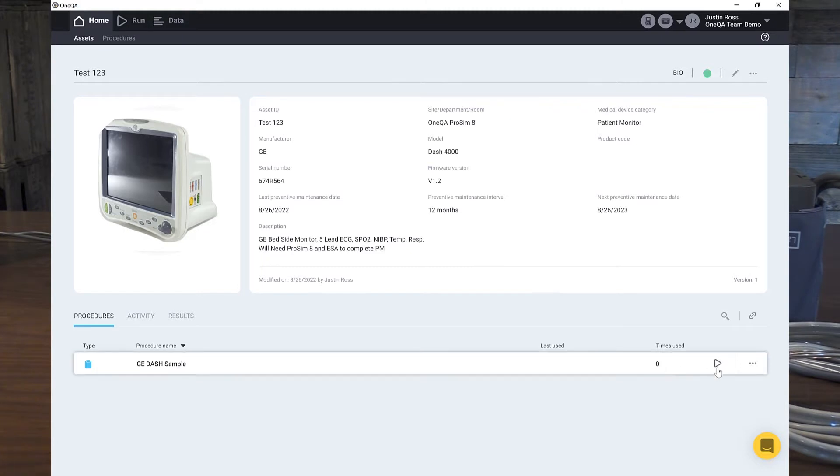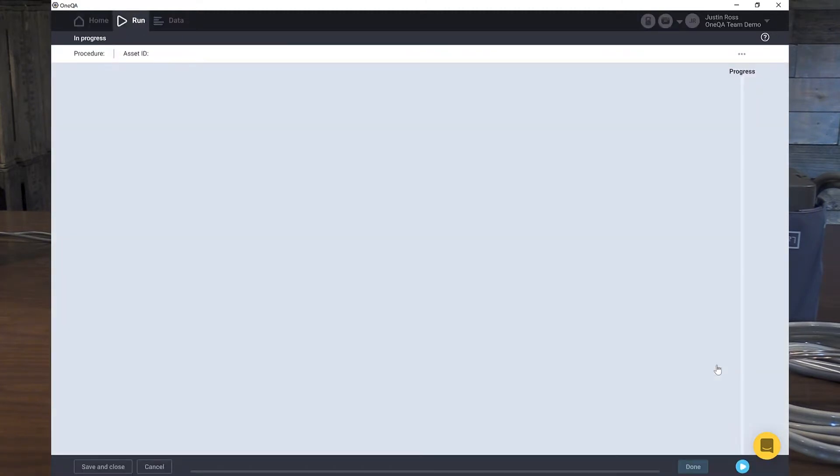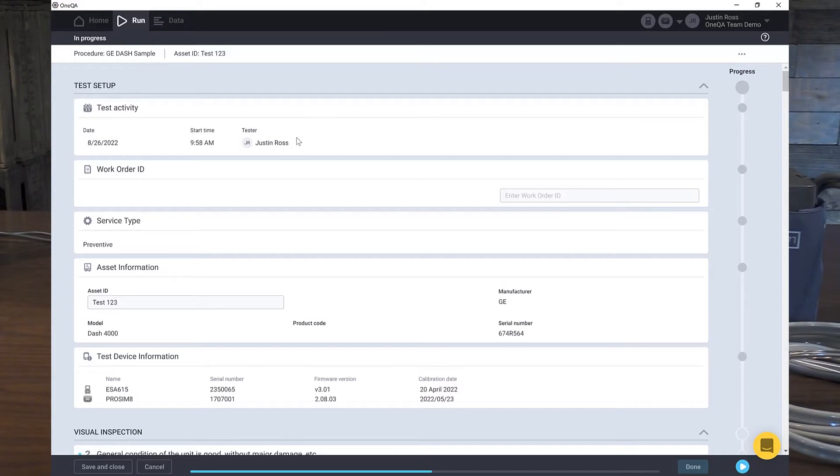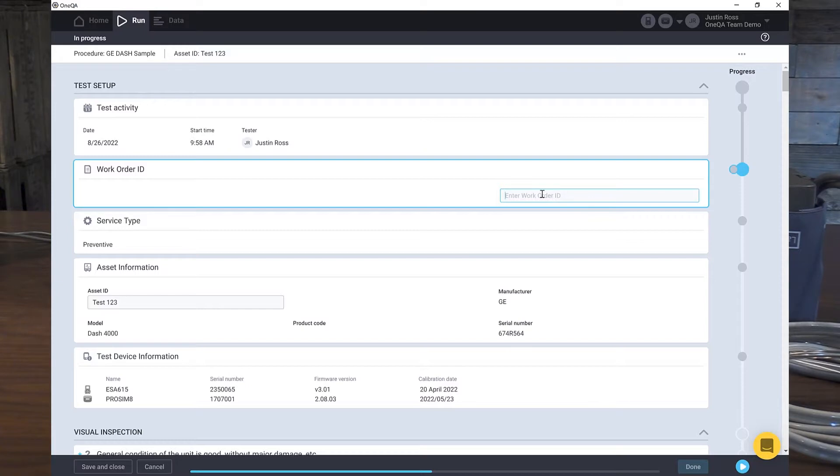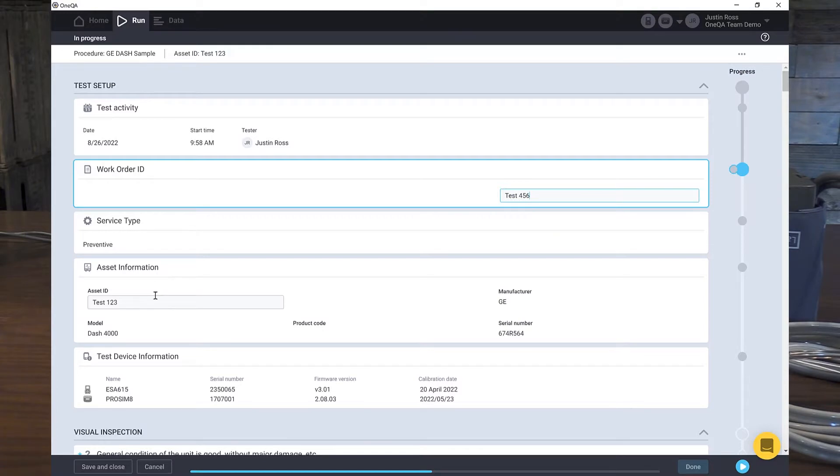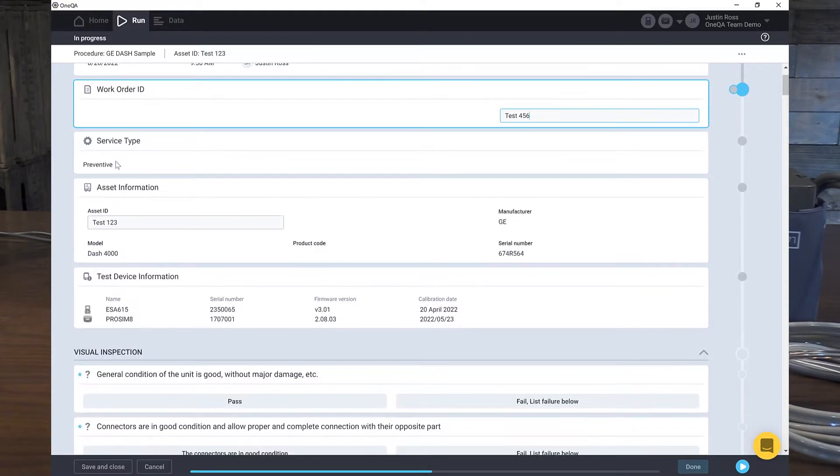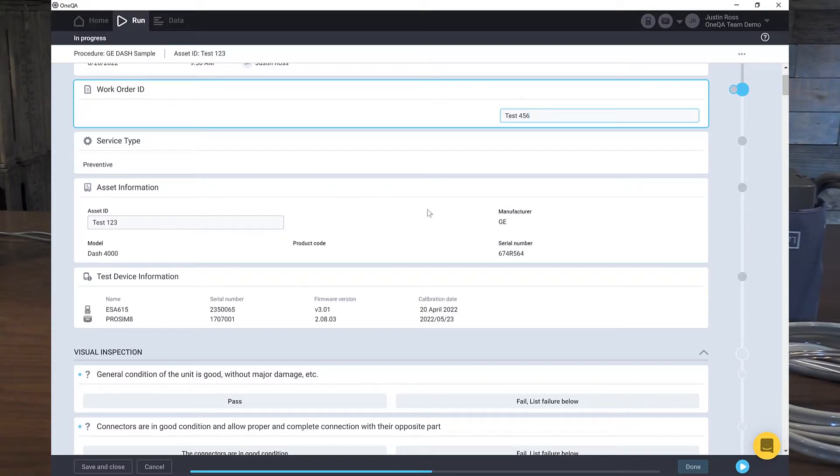So let's go down and start the procedure. We'll click Run. And here we are. We have the date, starting time, and the tester. This is myself and this is password protected so this is like my electronic signature. This is the first place we're going to interact with our CMMS where we can either, this will automatically fill from the CMS or we can enter it in. So we'll just enter in test 456. That's just made up number for today. We can see that we're doing a preventative maintenance type and here's the asset information, the asset tag, the model, manufacturer, serial number.